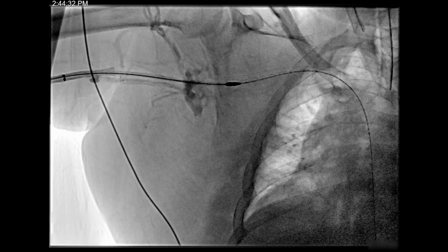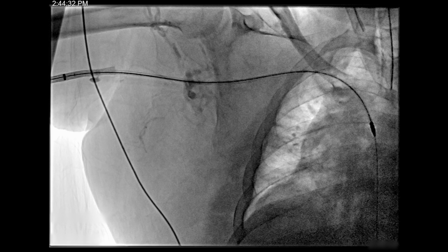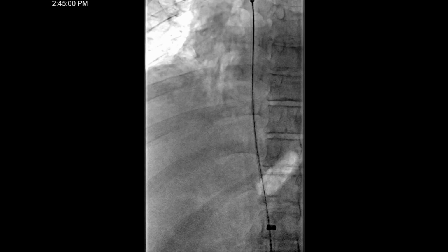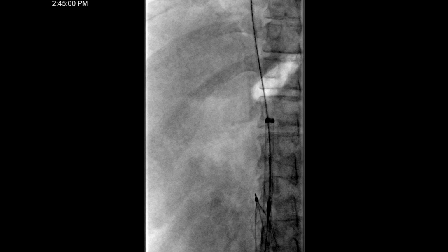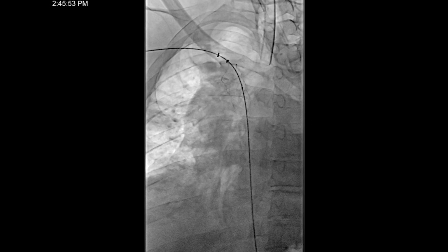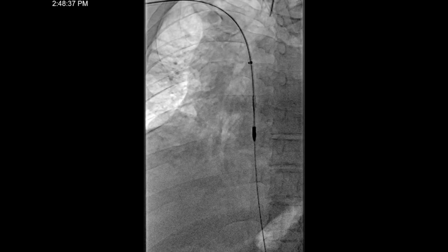Here you can see our clot-triever device passing through the veins over our wire. Very important, you will then notice that our camera then comes further down into the abdomen to allow us to watch our clot-triever device actually pass below our IVC filter under direct visualization. Very important so that it does not get snagged there. You can then see us pulling our clot-triever back to allow for thrombectomy of the veins.